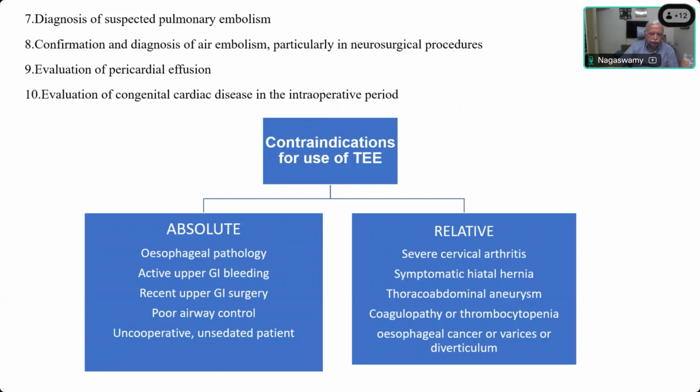But if it is being done during the induction period or in the pre-anesthetic induction time, and the patient is uncooperative, you should not do it. And the relative contraindications are severe cervical arthritis, symptomatic hiatal hernia, thoracoabdominal aneurysm, coagulopathy, esophageal cancer, or varices or diverticulum.